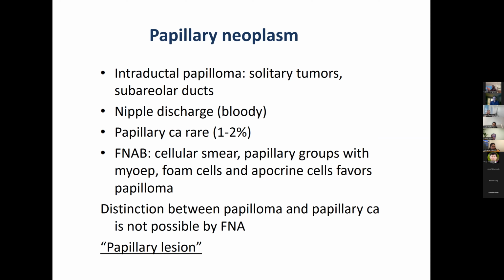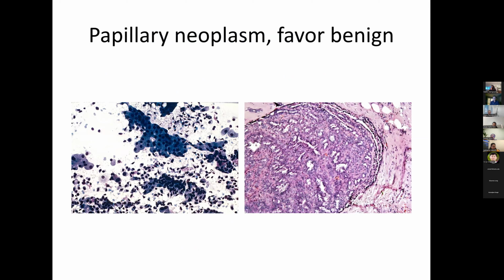But on cytology, it is very hard to distinguish a papilloma from a papillary carcinoma. So we would just give a diagnosis of a papillary lesion. And when the clinician sees a diagnosis of papillary lesion, they know that they have to go for a surgical biopsy or excision. Here's an example of a papillary neoplasm.